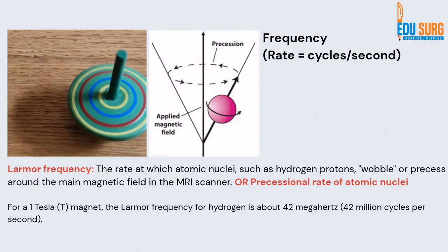But at this point, I hope you have understood what the M of MRI stands for. So it is a magnet. The magnet causes proton alignment and it also causes the protons to move at Larmor frequency. So two purposes of M. Okay. Now we go to resonance.